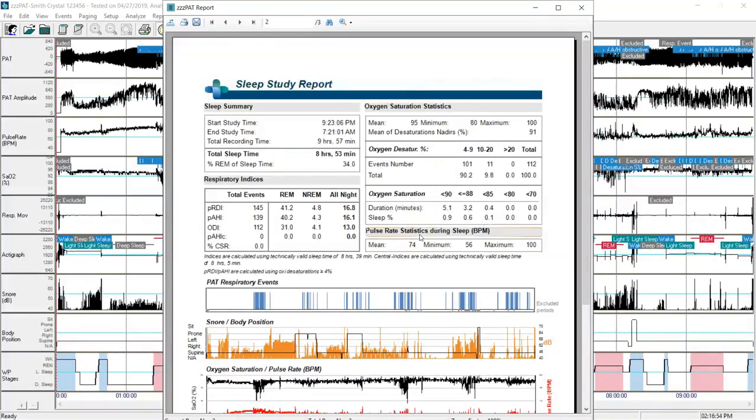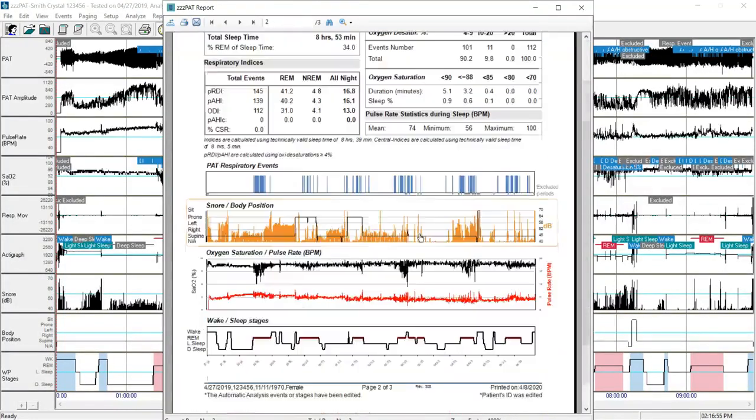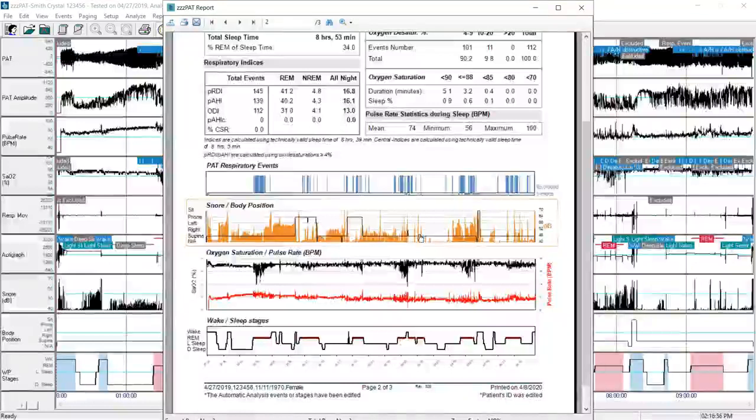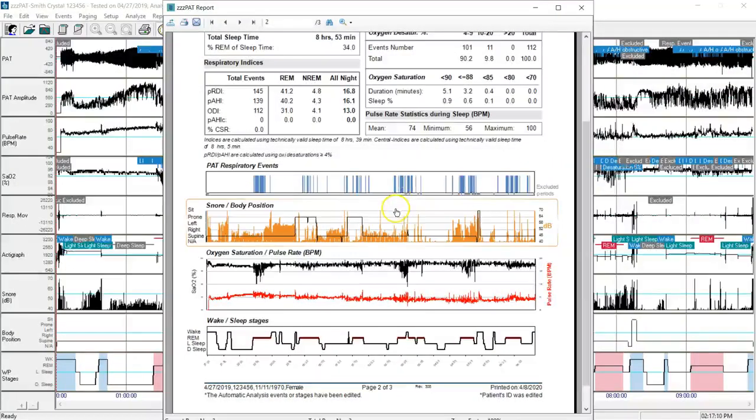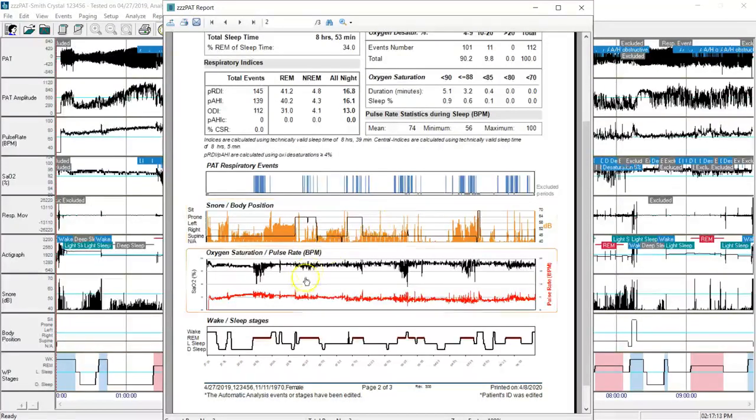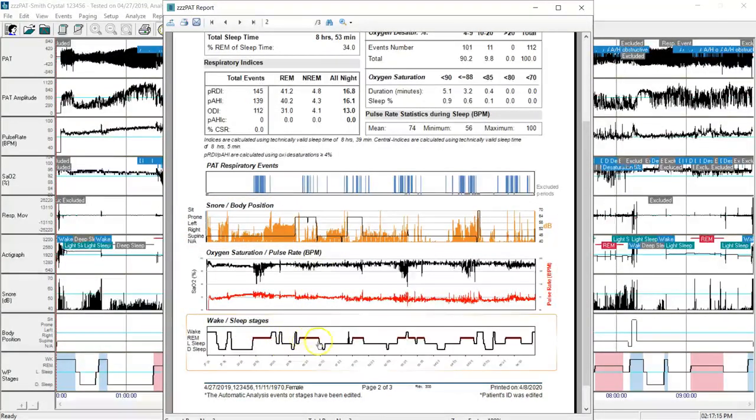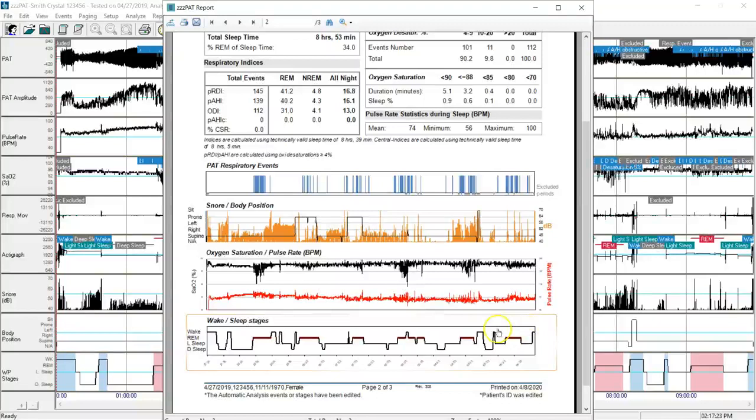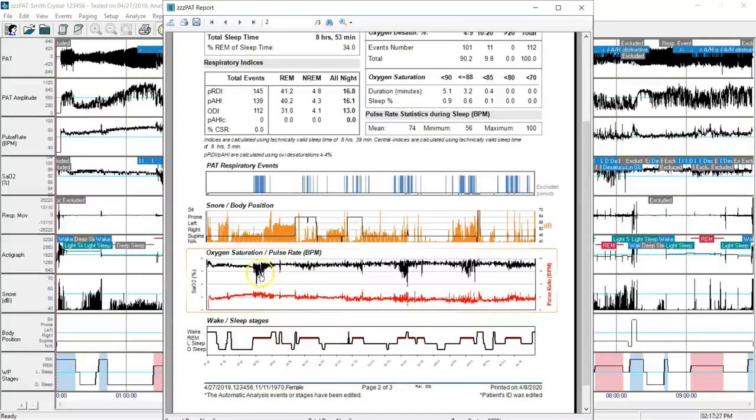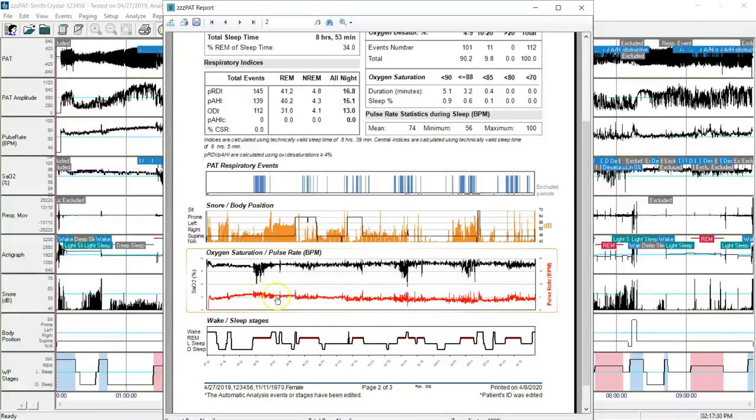I can continue down through the study to look at the other hypnograms to review other information that will help me in my diagnosis and interpretation. I can see down at the bottom the areas that are marked in red are those periods of time where the ZZPAT software believed the patient was in REM. And I see those match up quite closely with drops in oxygen saturation and heart rate acceleration.